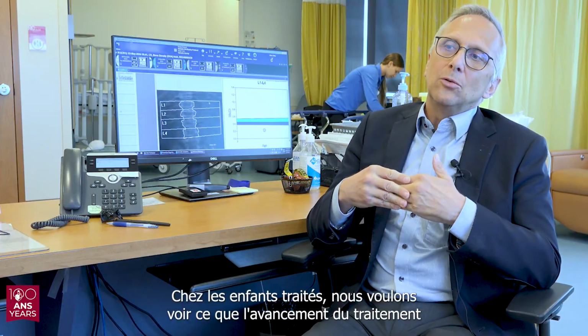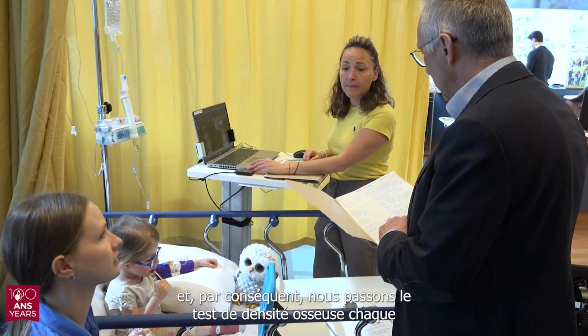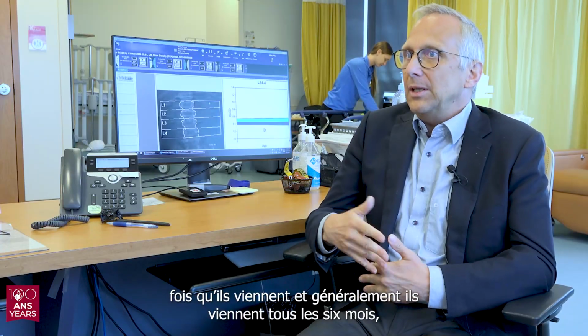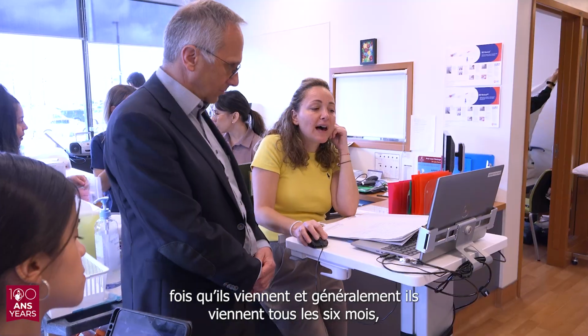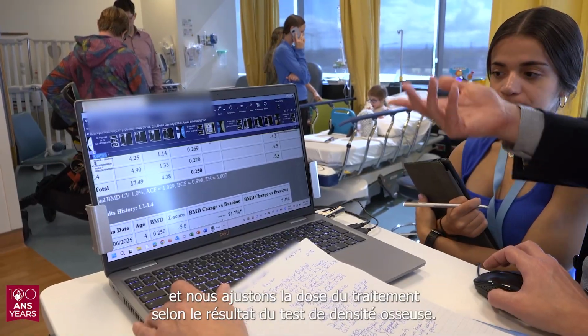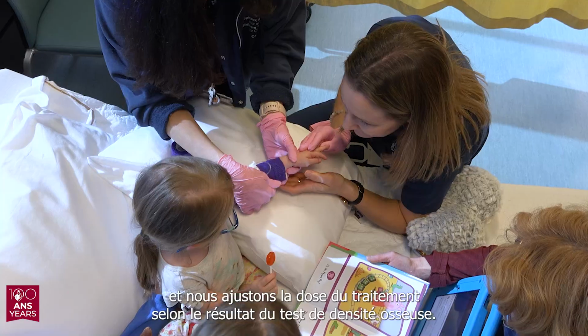In children who are treated, we want to see what the treatment is doing, and therefore we take the bone density test each time they come, and typically they come every 6 months. Then we will have a new result every 6 months, and we adjust the dose of the treatment depending on the result of the bone density test.